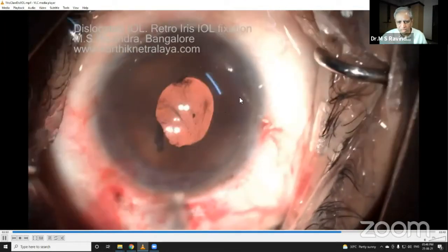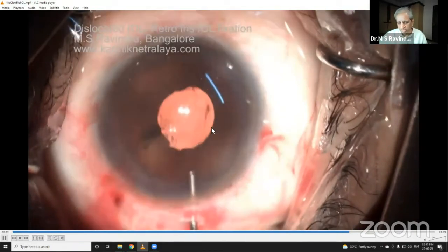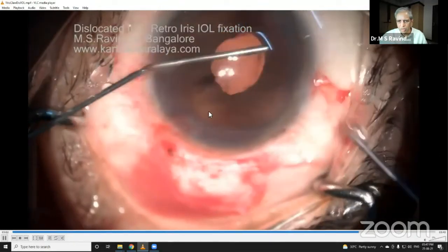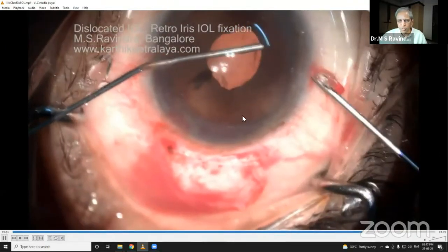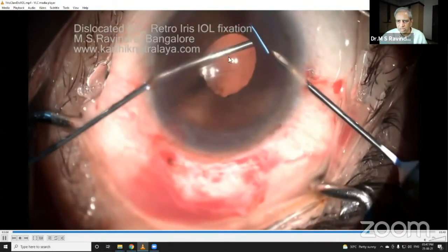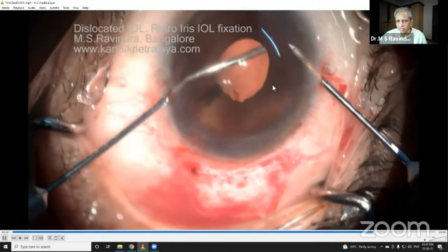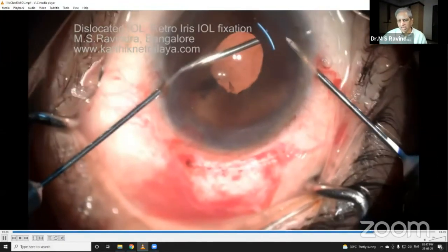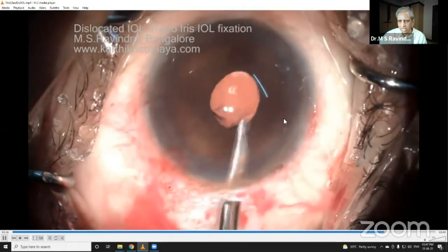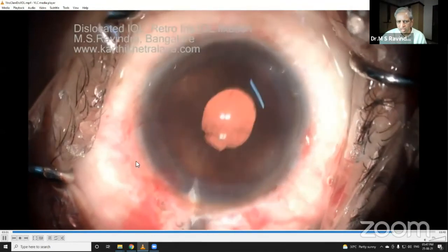I don't have to do a vitrectomy. I'll remove the viscoelastic from the anterior chamber and angle region to prevent secondary glaucoma. I'm doing an iridectomy manually because I have not used a vitrectomy probe. I support the back of the iris with the cannula from that side and pierce with a fine needle — the iridectomy is done manually with a needle and a supportive element.